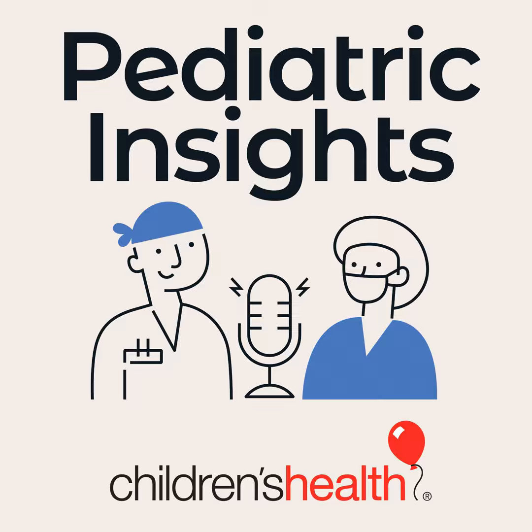So when it comes to robotic surgeries, and you were mentioning kidney surgeries, bladder surgeries, reconstructive surgeries, are there any preferred tools or methods specific to the team? There is a nice method that was originally conceived of by Dr. Patricio Gogolo when he worked here. He's now up at Mayo Clinic, where he put the small incisions through which we place the ports that the instruments and camera go through to go inside the body. And he put them all below the bikini line. So it hid the incisions. And so he called this the hides technique for hidden incision for certain types of procedures.